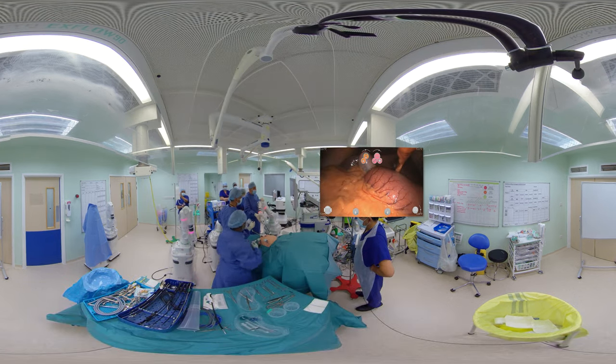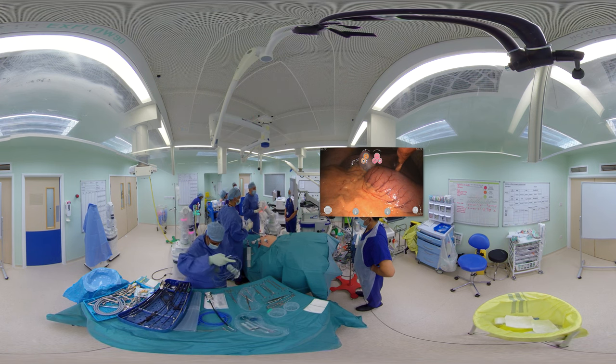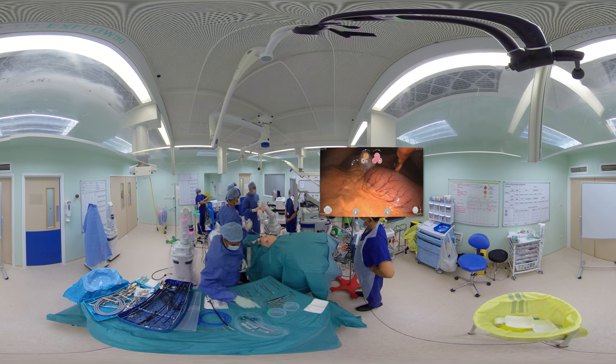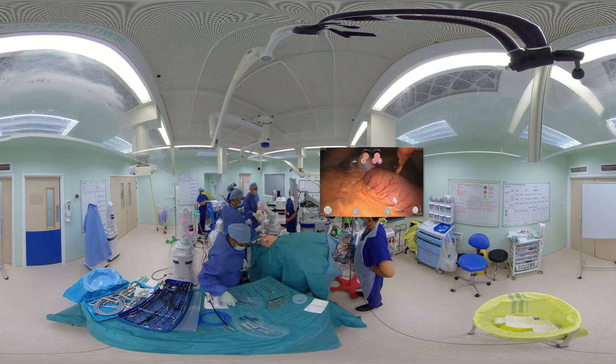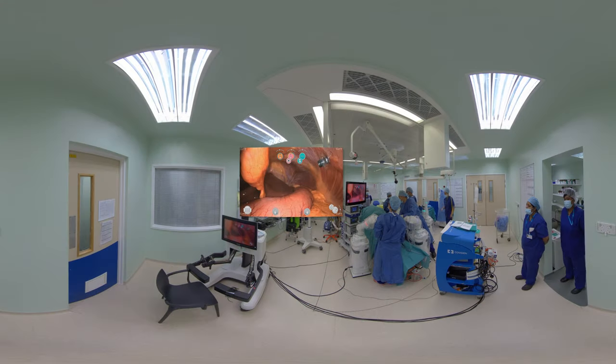If you now look at the patient, we are performing what we call port training. This allows the robotic arms to know where they are in relation to the abdominal wall of the patient and helps with the movements of the instruments. Once this is done, we can insert the instruments into the abdominal cavity.